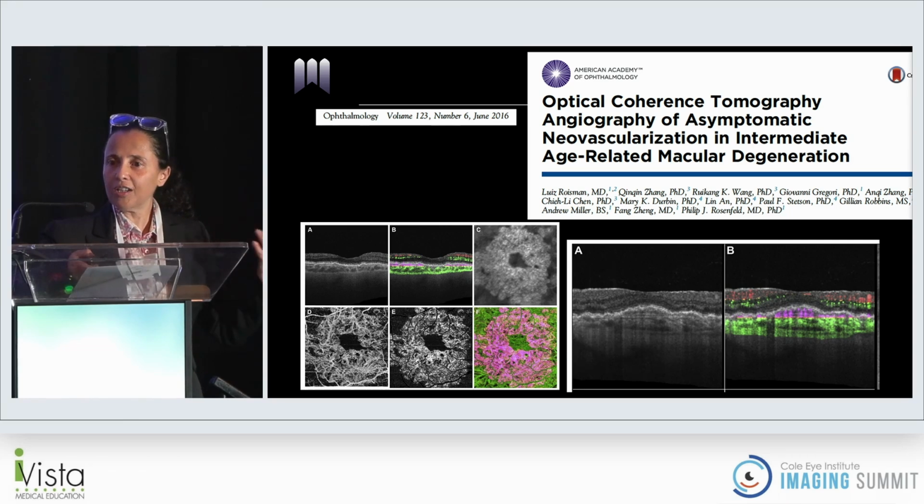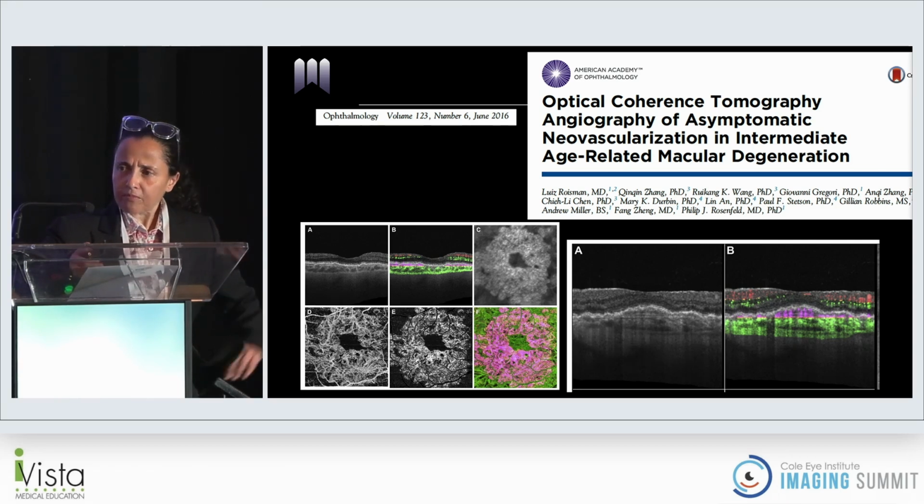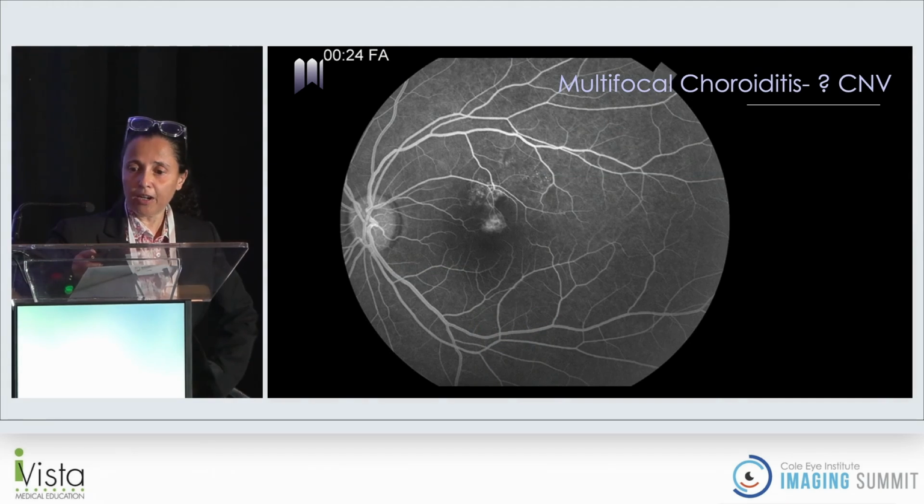In the past, you used to need an ICG angiography to reveal these lesions, but now with OCTA, we could see them. And if you start to look at your OCTs in the drusen patients carefully, I'm seeing more and more of these sort of hiding under the RPE.